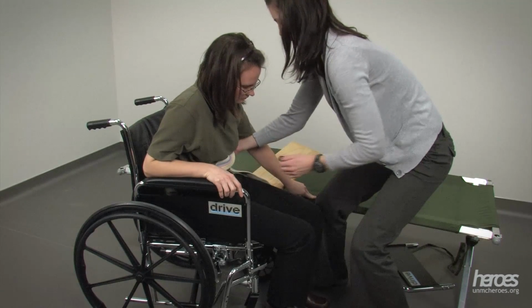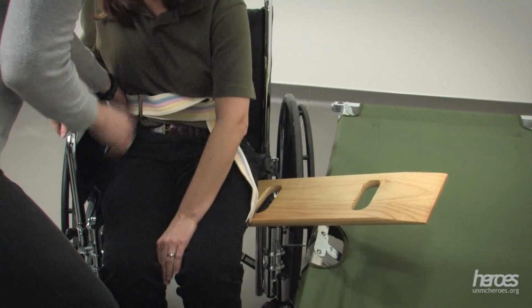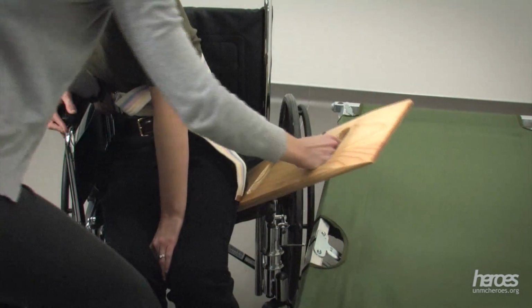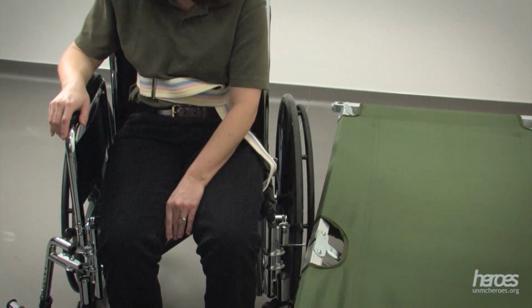Once the individual is all the way onto the wheelchair, have them lean away from the slide board so that you can more easily remove it. Make sure to have one hand on the gait belt as you remove the slide board.